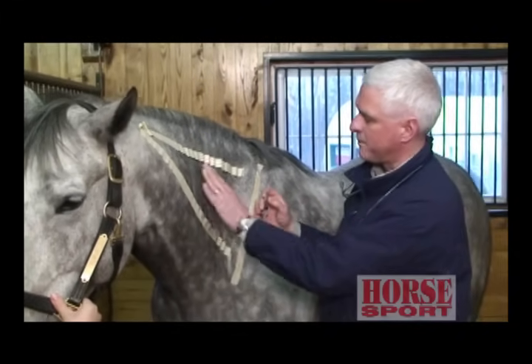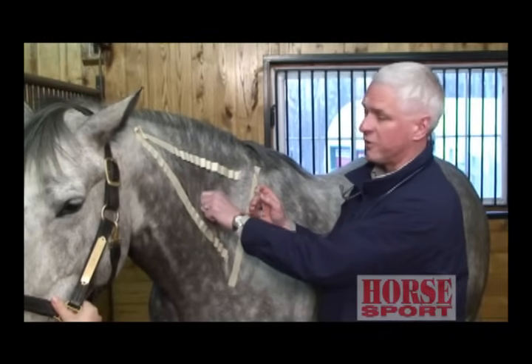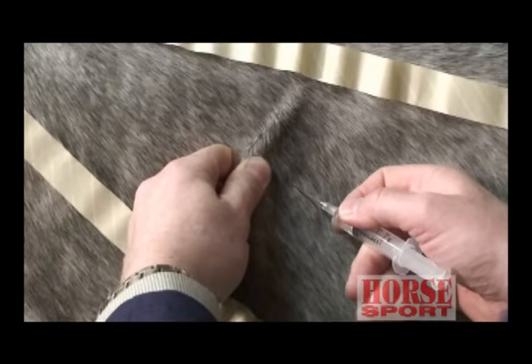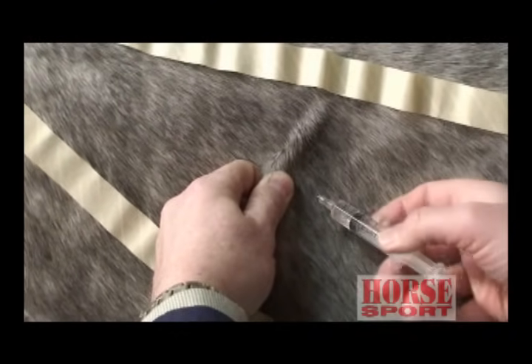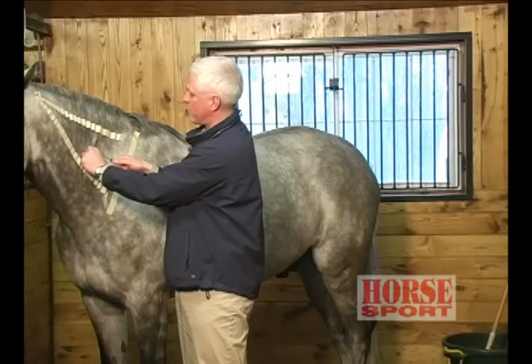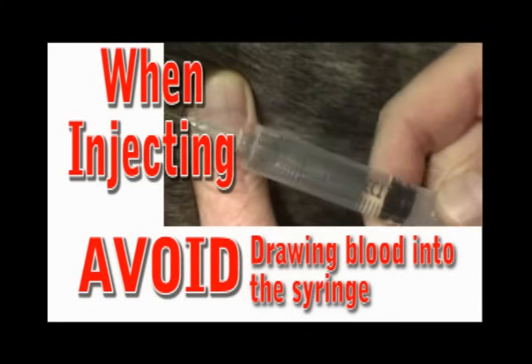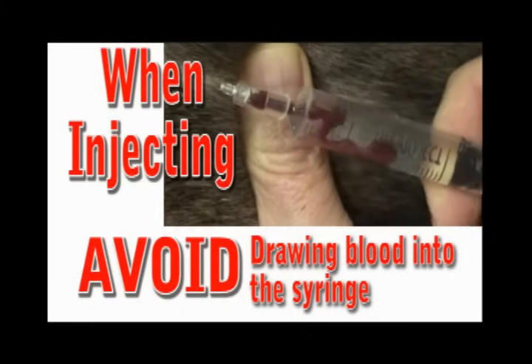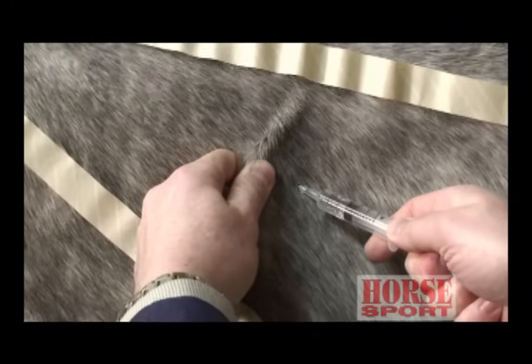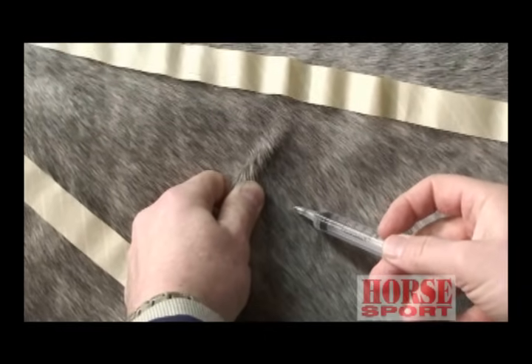How we recommend giving an injection is to take a slight pinch of the skin, which will distract the horse. Insert the needle at an angle, slowly, deep up into the hub. Before injecting the medication, you always want to pull back to make sure you don't have blood coming out. Sometimes you'll go through a small blood vessel, and we don't want to get the medication into the blood supply — just into the muscle. Once we know for sure that there is no blood in the syringe, we're then able to inject our medication.